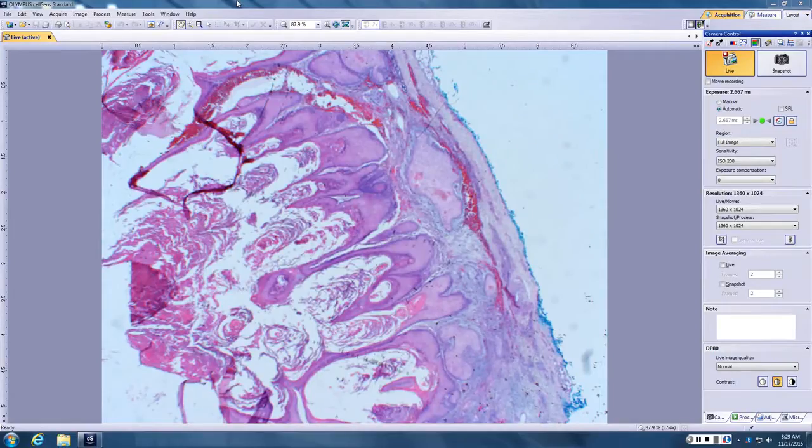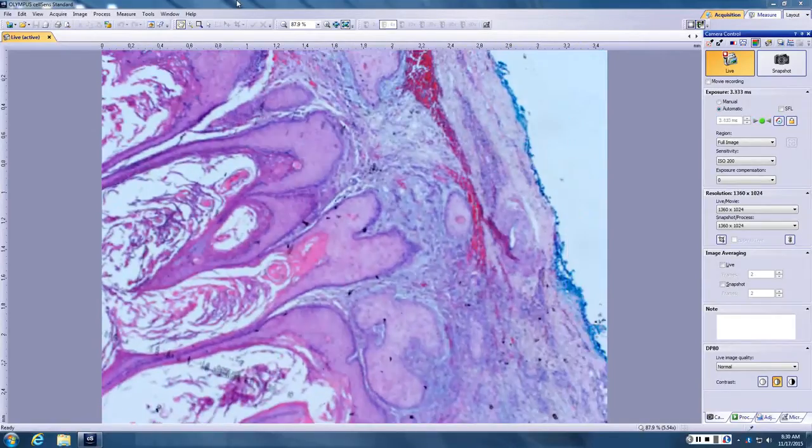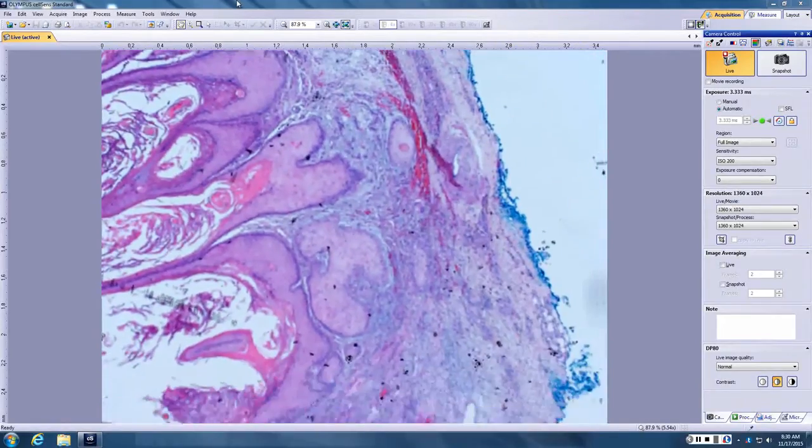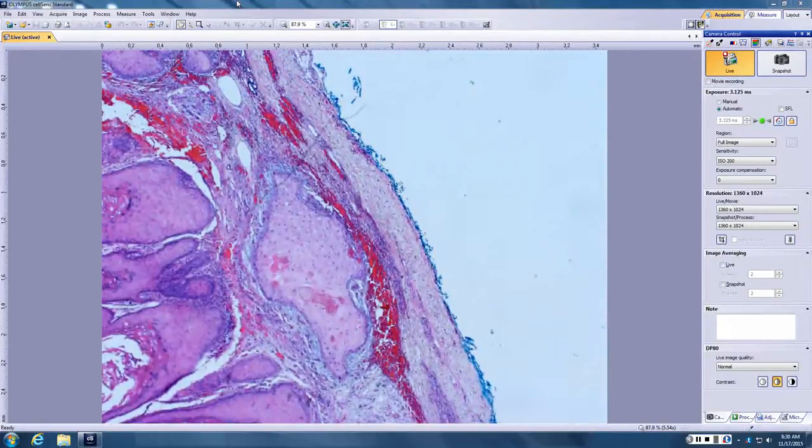Okay. And for the KA, the presence of neutrophil microabscesses, elastic trapping at the periphery, and eosinophils in the infiltrate are all clues that it's more likely to behave as a KA than as a conventional squamous cell carcinoma. That gives you the options of injecting methotrexate or 5-fluorouracil as options to excision.